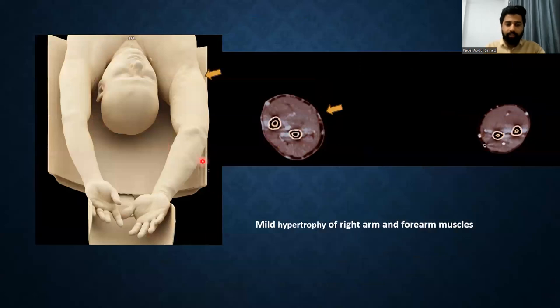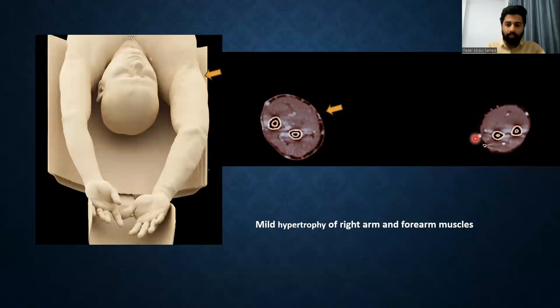On this image, we can see there is a mild hypertrophy involving the right upper arm and forearm. The mild hypertrophy of the right arm and forearm muscles are also noted. Also, we can see the visualized radius and ulna, which appear to be larger as compared to that on the left side.